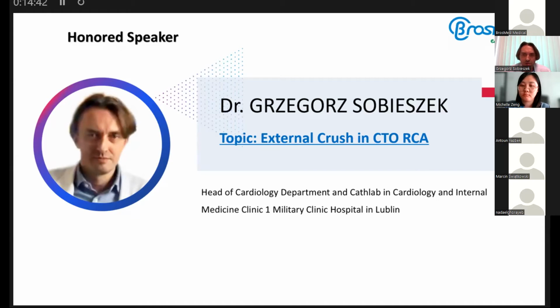And I think Alveo is very useful, because in the last years we have had a problem with very small balloons to pass the lesion. And of course, we have other options. As we can see, we can go first with a balloon.